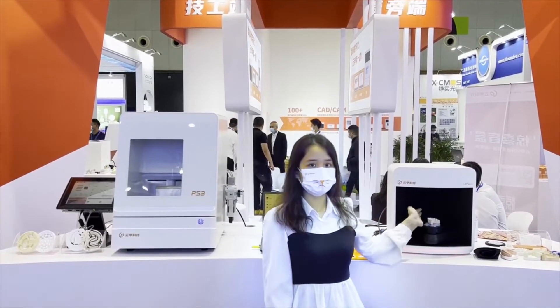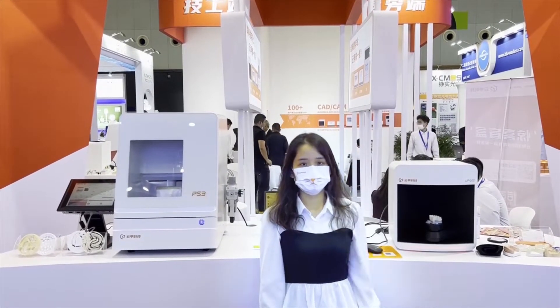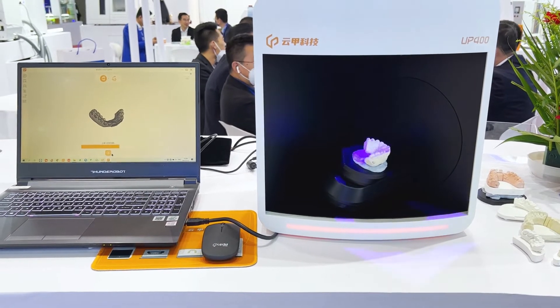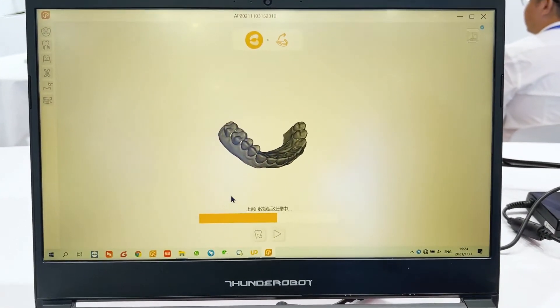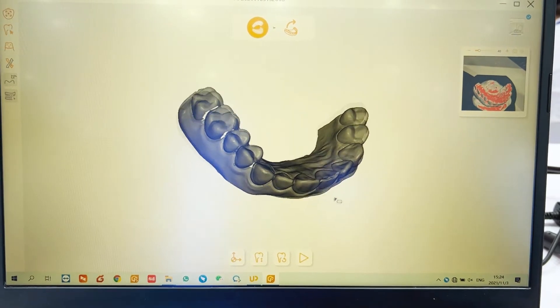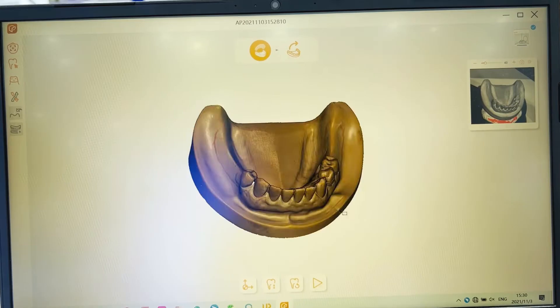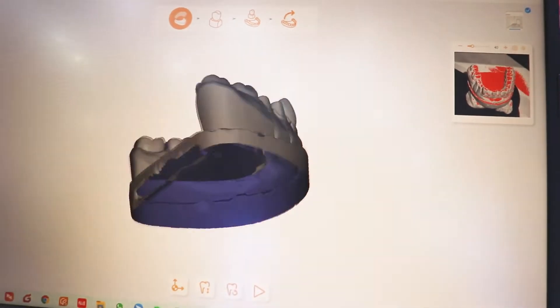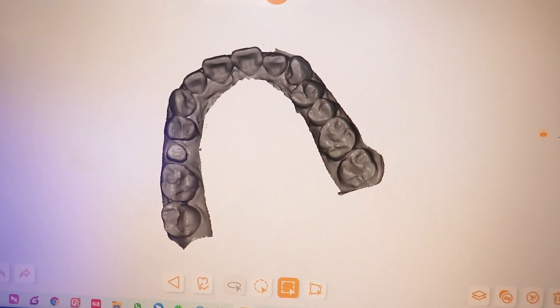Let's see the lab-side solution first. Here's a R400 scanner. It's newly upgraded with ultra high speed. We have improved the scanning engine and algorithms with its high resolution cameras and powerful projector. It takes only 12 seconds to scan the full arch and it is ideal for partial dental design for its excellent color texture scanning. The most amazing point is that R400 can scan the very narrow gap of the model without blind angle, so you can easily scan for orthodontics, veneers and unsubtracted models.